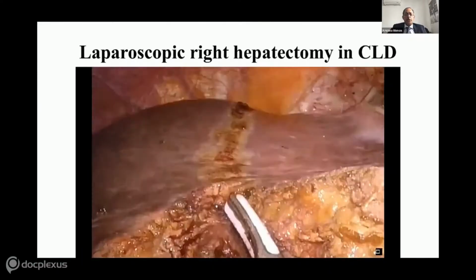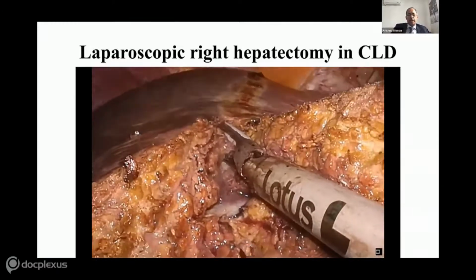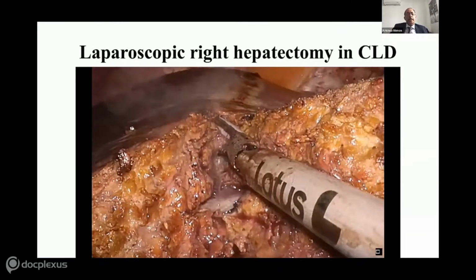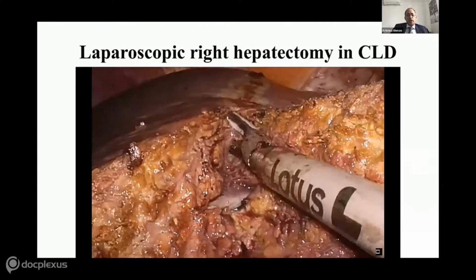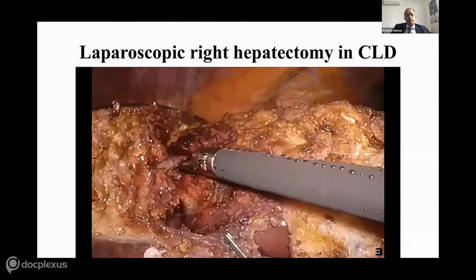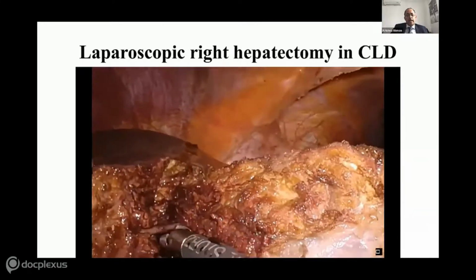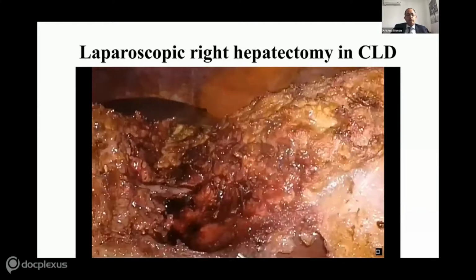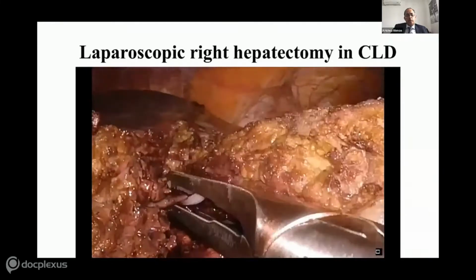And you can dissect this exactly as you do with a Couser, both above and below the vessel. And always make sure you clear the parenchyma beyond the structure before you start clipping it, so that if you do run into bleeding, then you can control it much more efficiently. So the transection, again, it's a slow device, but you can see here now you use a Leahy to go around the V5. And then once you go around the V5, you can use a Hem-o-lok to occlude the blood vessel and then divide in between.